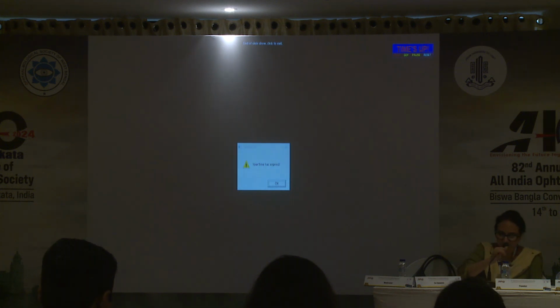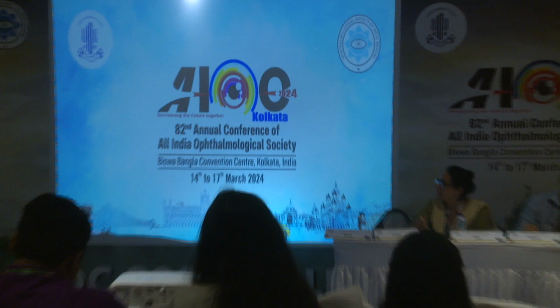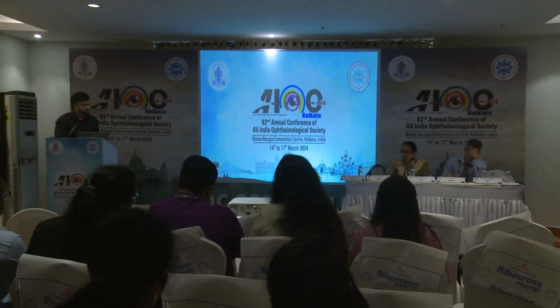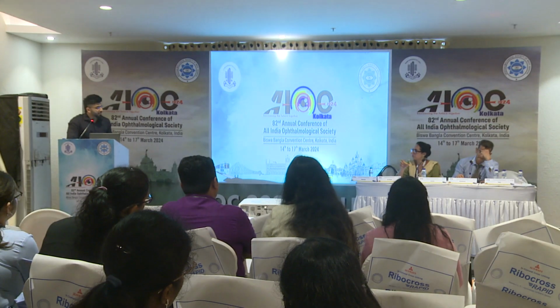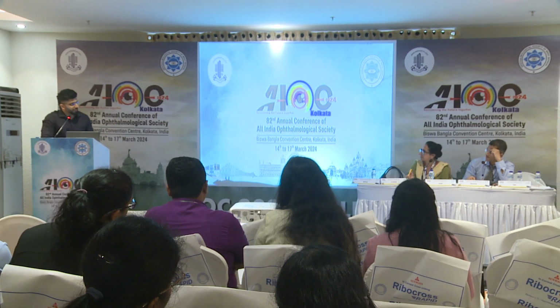Good. New technologies, Dr. Ashish. But as you said, the cases which you took were of all types of choroiditis. So if you say quadrant-wise, where were the choroidal tubercles or choroiditis patches? That would affect the various quadrants.